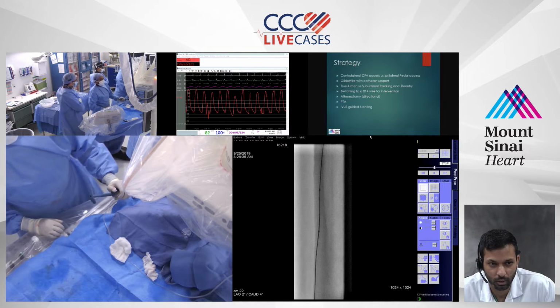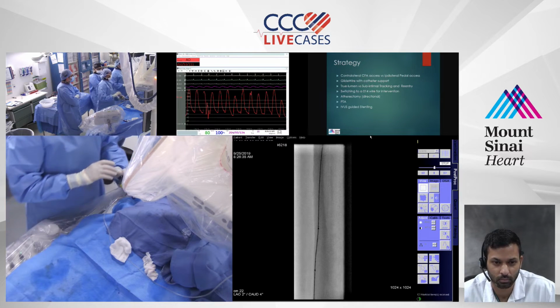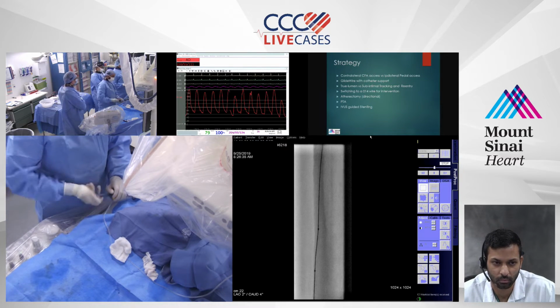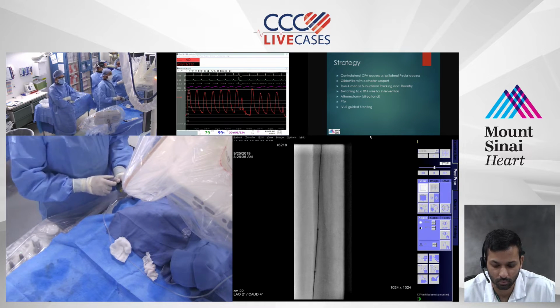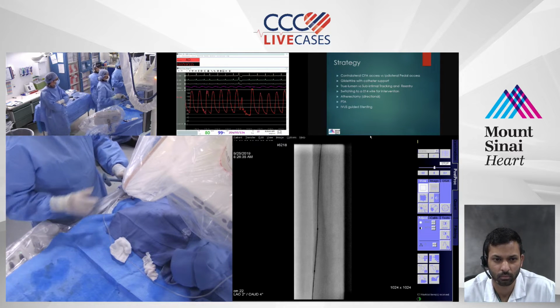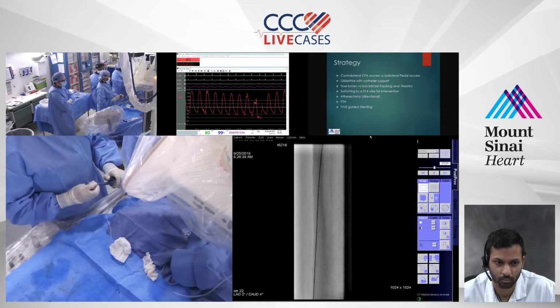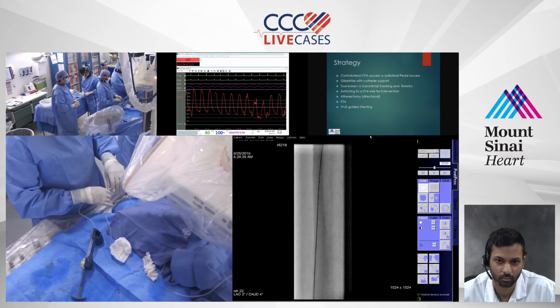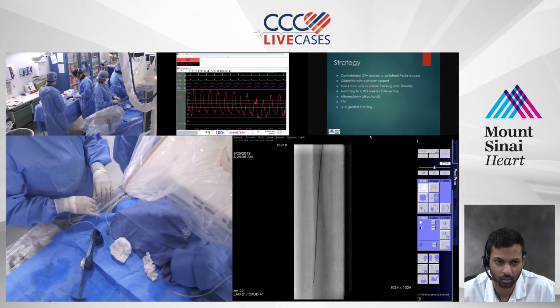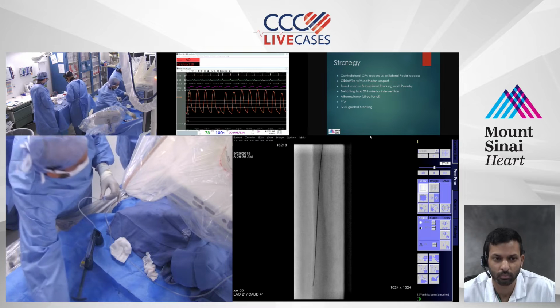Also, I think it's important to comment on one thing that I know we've done together, which is not to angioplasty too low. I know that he has a distal reconstitution of this vessel where technically you could do a below-knee bypass if you needed to, so we try not to go too low. We're just going to balloon up to that reconstitution zone, and then I'm going to put a support catheter in and change this out. A lot of times I think cardiologists just balloon all the way down, and there's no reason to. Why create barotrauma?